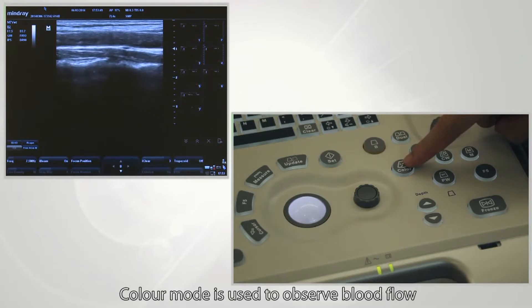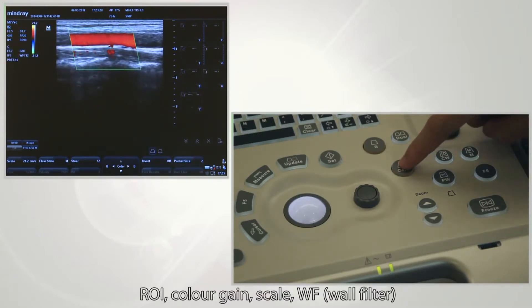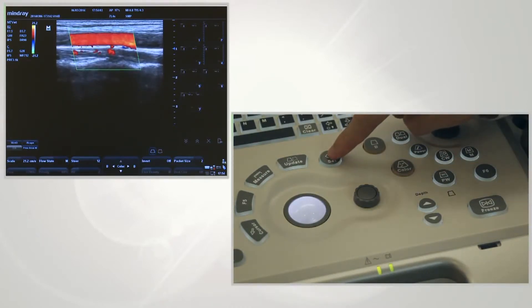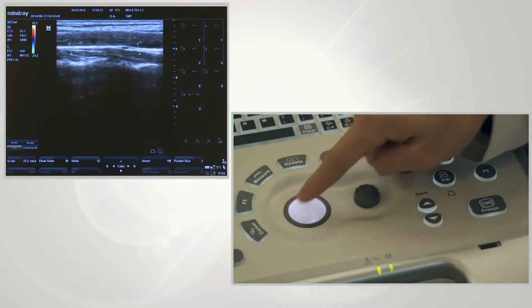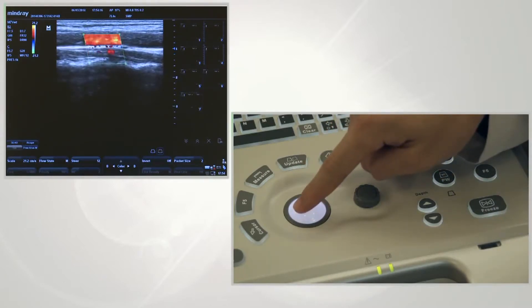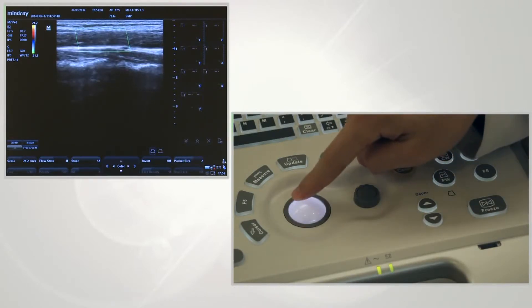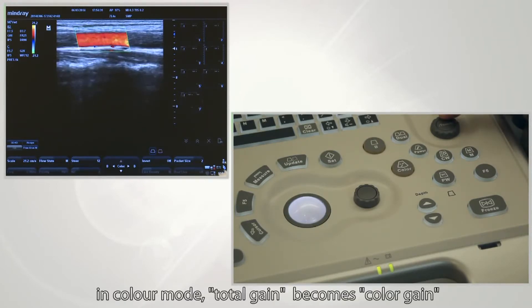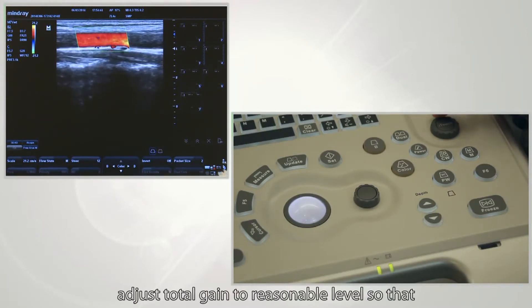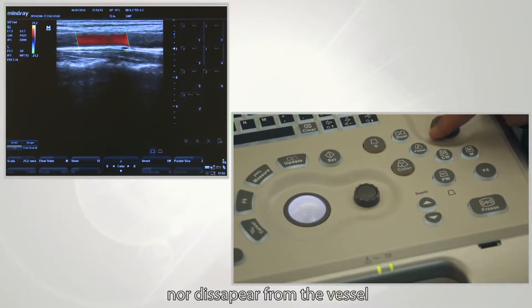Color mode is used to observe blood flow. Use ROI, color gain, scale, and WF (wall filter) to configure the display. Press set and roll the trackball to adjust the size and position of the ROI. The bigger the ROI, the lower the frame rate. In color mode, total gain becomes color gain. Adjust total gain to an appropriate level so that the blood flow will not exceed the vascular vessel nor disappear from the vessel.